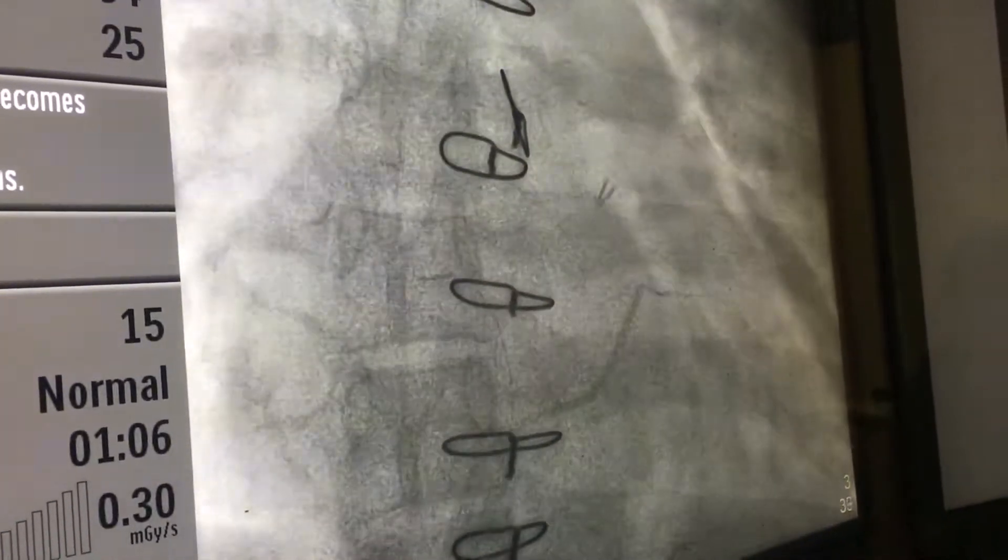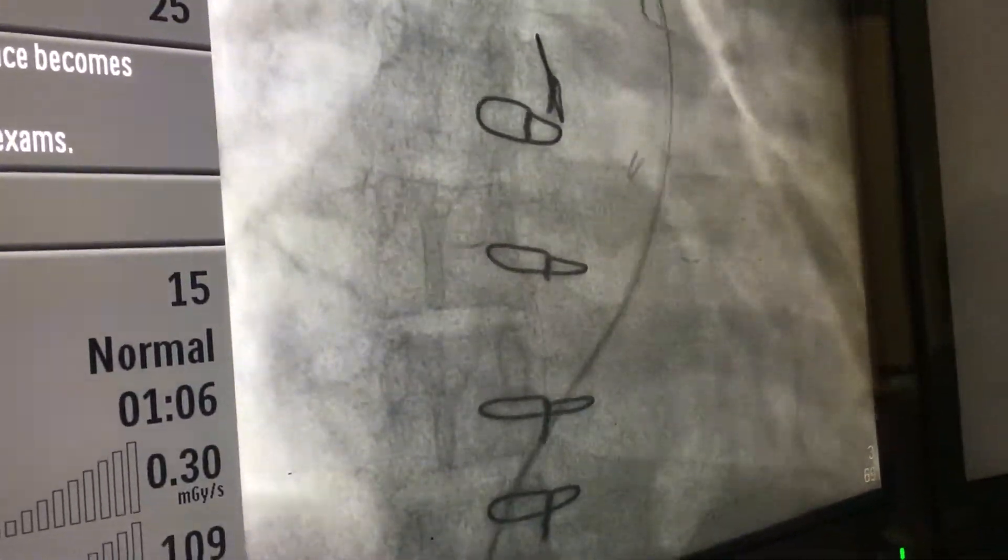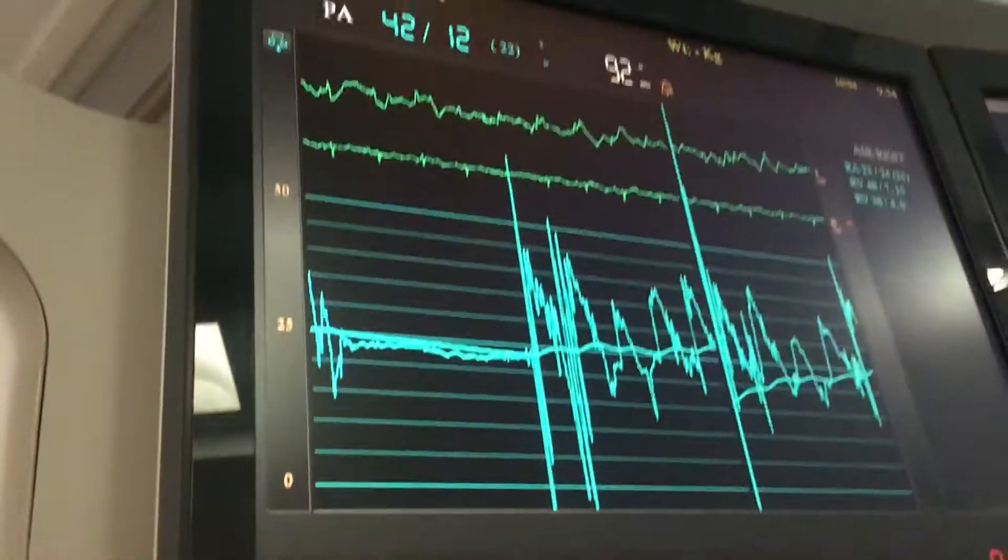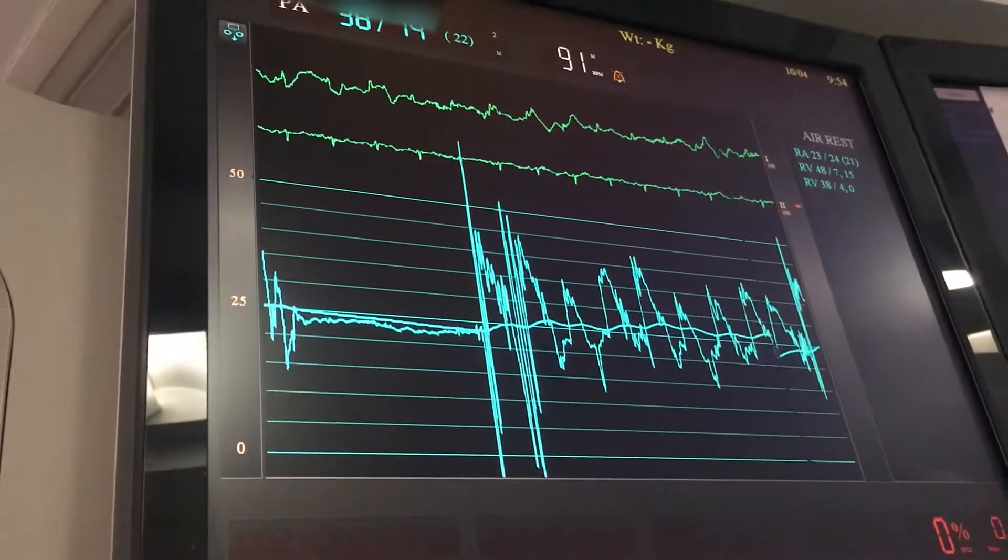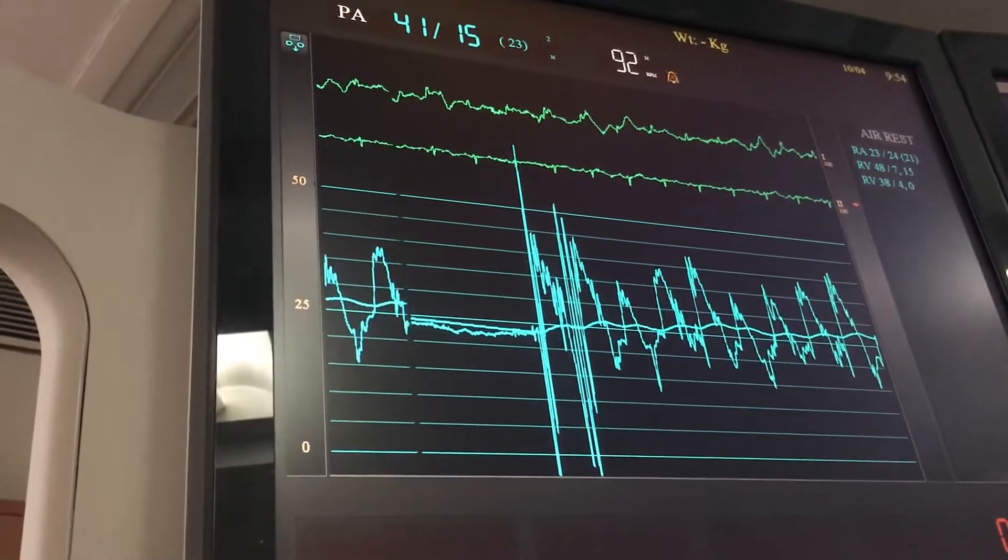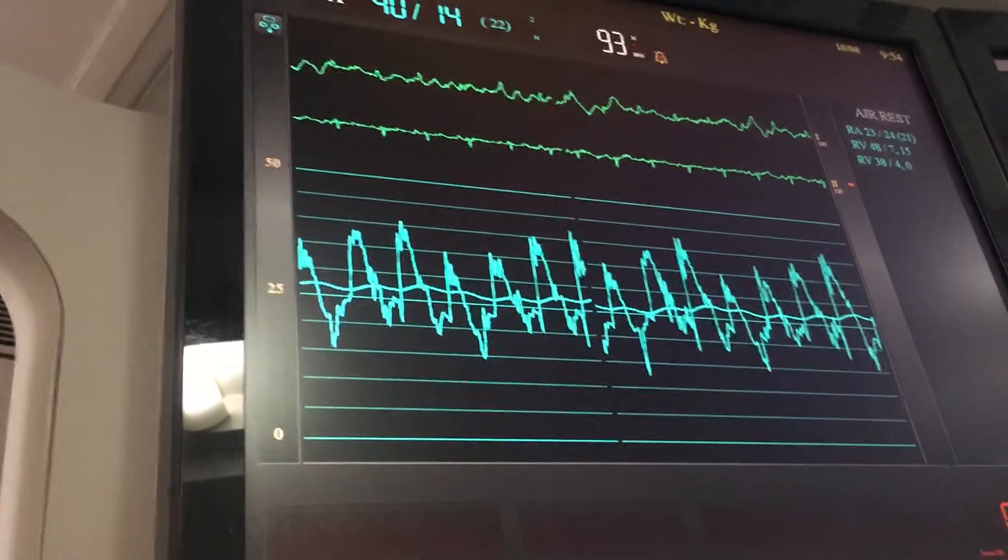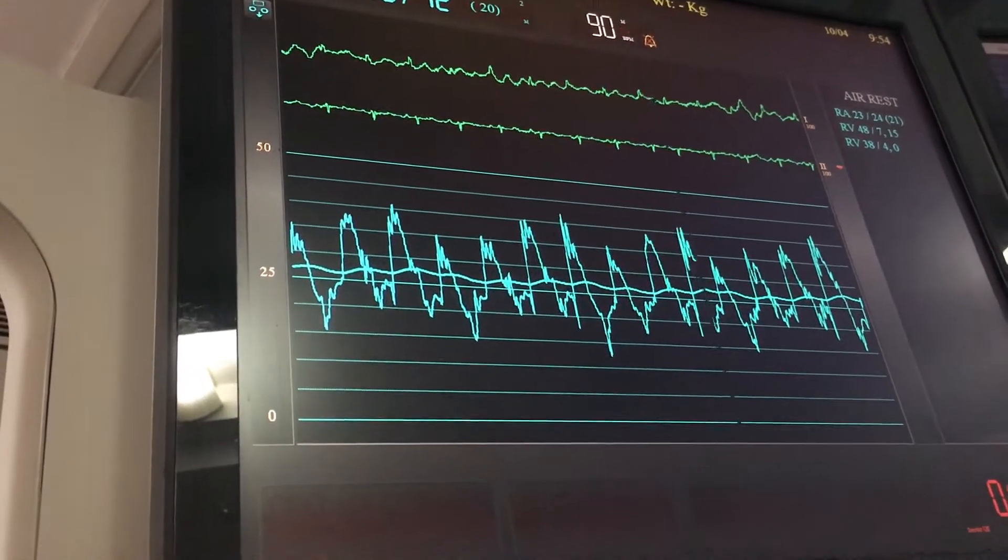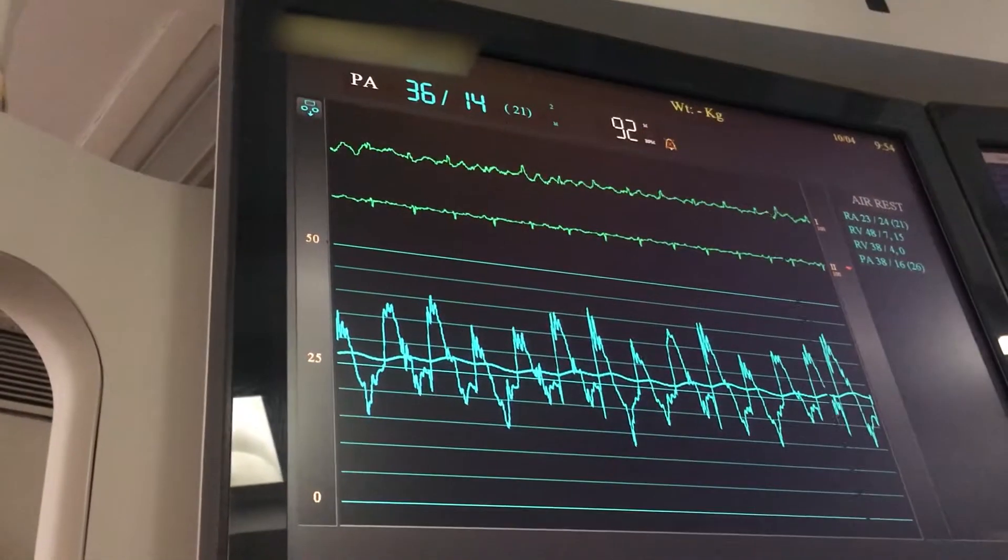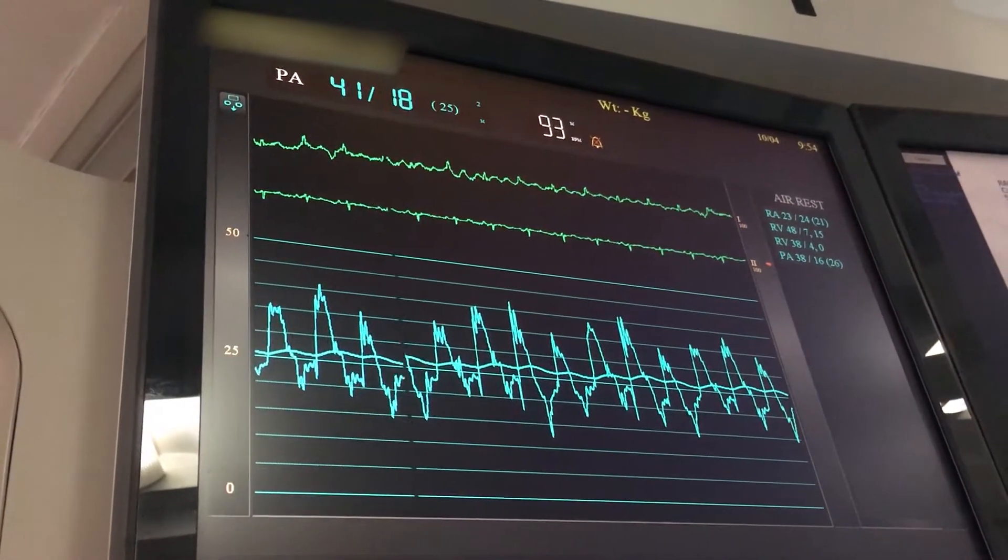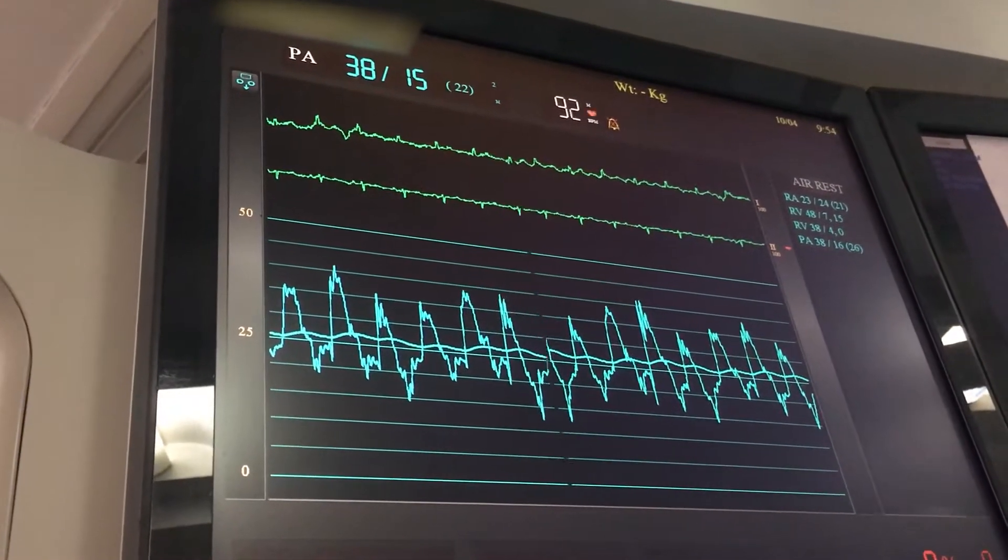I am just going to measure the PA pressure. I am just touching the catheter. Yeah, show the PA pressure. So it is better to have a cath measurement before going for a biopsy, and especially for post-transplant patients. Yeah, so these are PA pressures.